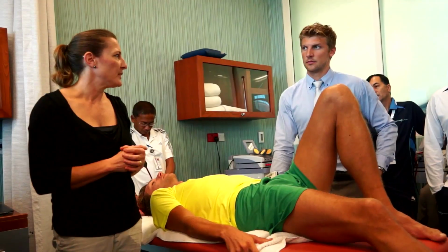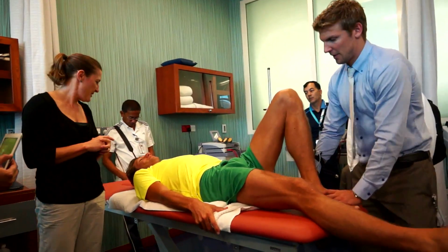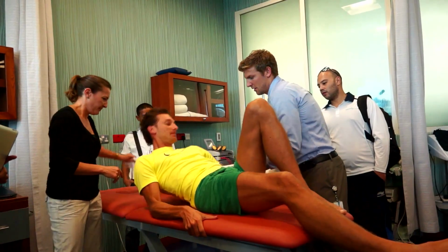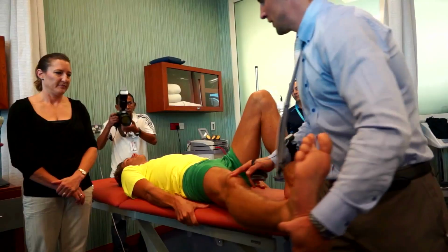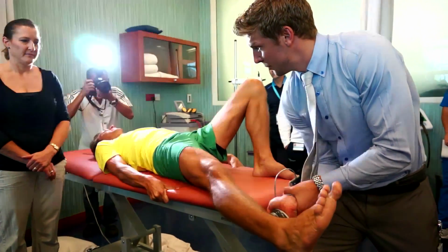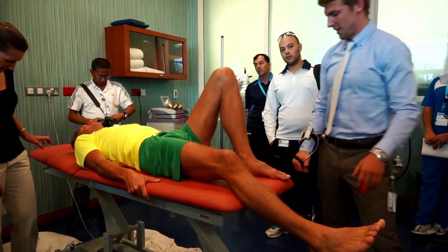Do you want to do it quickly one more time? One more time. Ready? Down here. Without the towel. And he's going to be sliding. And go ahead. Push, push, push, push. There you go. Okay, we need to lock it.